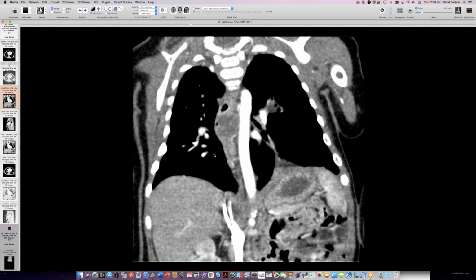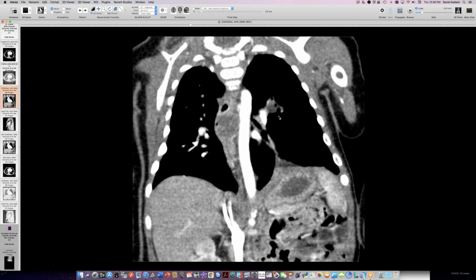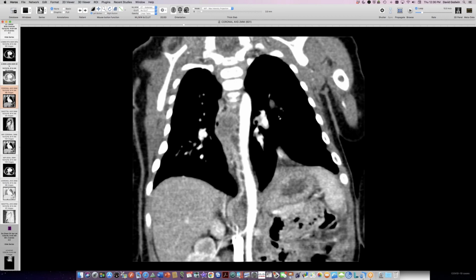That's a good one there. Yeah, I agree with you. I think that's probably bronchial atresia given the bronchocele or mucocele. Right. And it's interesting at this point, this child being so young, it looks as if the mucus hasn't dried out and hasn't become one of those firm, bullet-shaped, chronic mucus plugs. It's still kind of liquid and soft looking at this point.